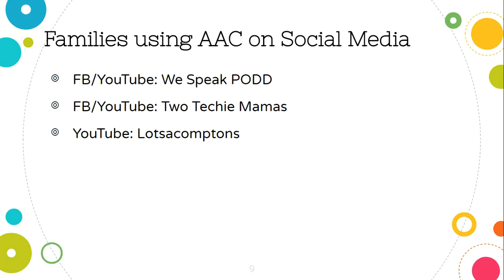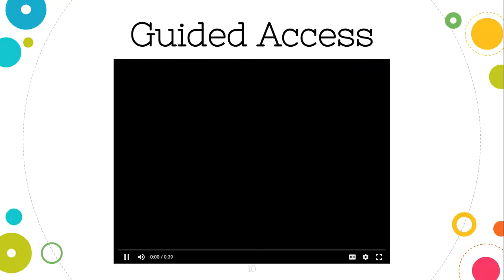If, through your social media accounts, you come across another family that you really like, please feel free to share, because I'd love to be able to give additional resources to families, and even better if they're vetted by other families in District 205. So now we're going to talk about guided access.